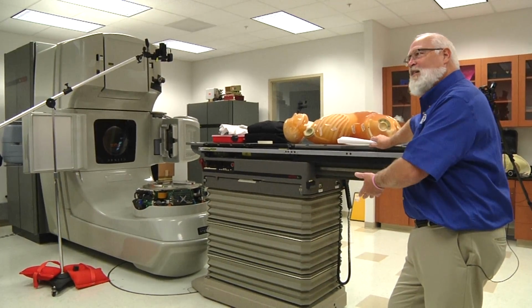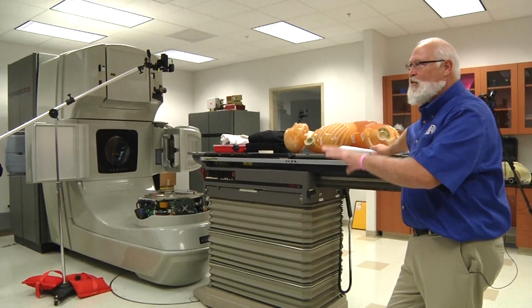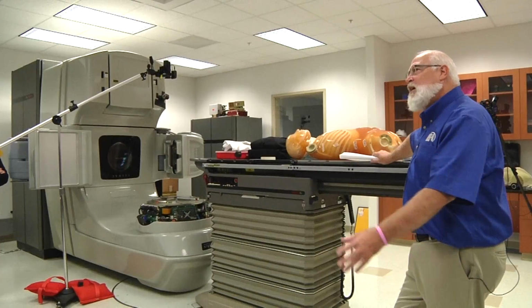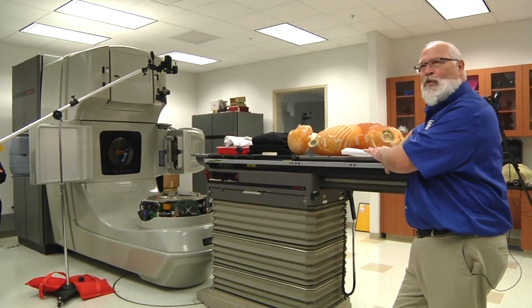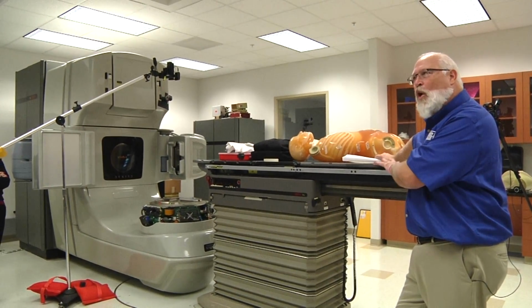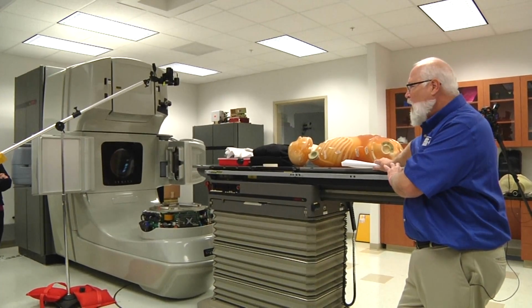And at the beginning I said it gives a lot of stress to everybody in the department, your patients and your engineer. So your service contract is generally geared around the uptime of your machine, keeping it running. And that's why we do all the inspections and checks that we do.